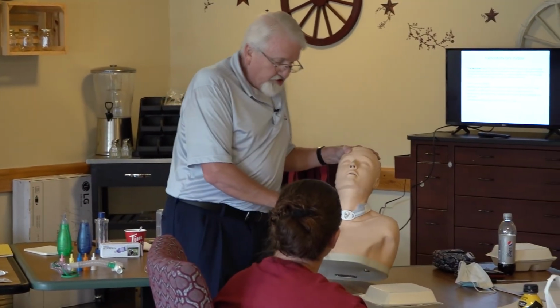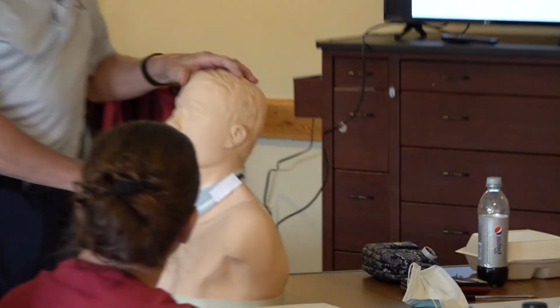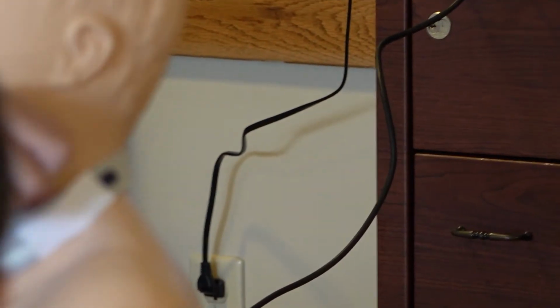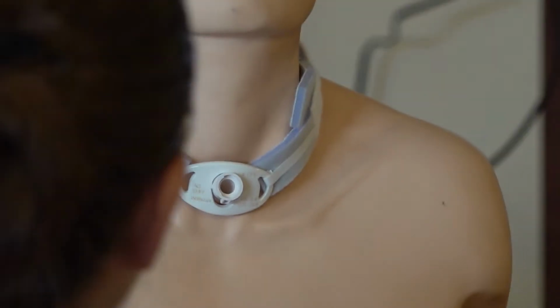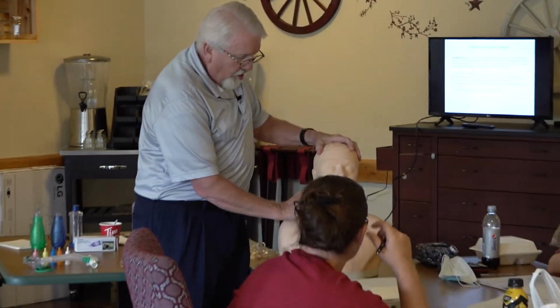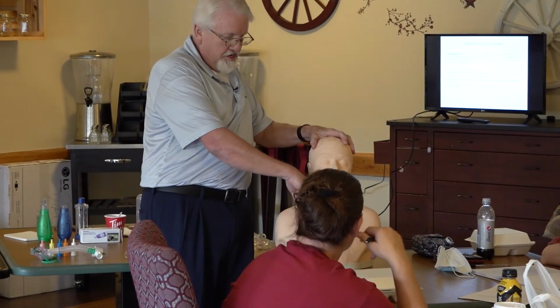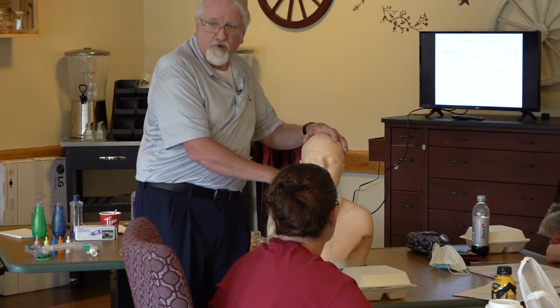All right, so I've got his new collar on. The big thing with collars is, now these are a little bit challenging in that they've got all that elastic. Okay, so you've got a little bit more give than like the Posey brand or those that don't have any elastic. So you always want to have 2 fingers between the neck and the collar where you can move it.